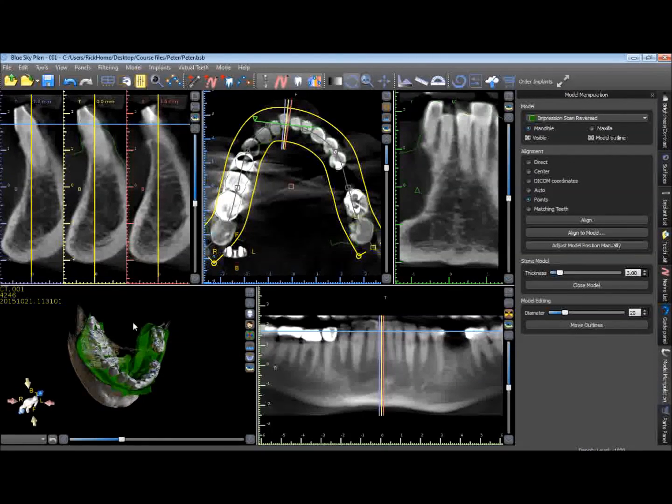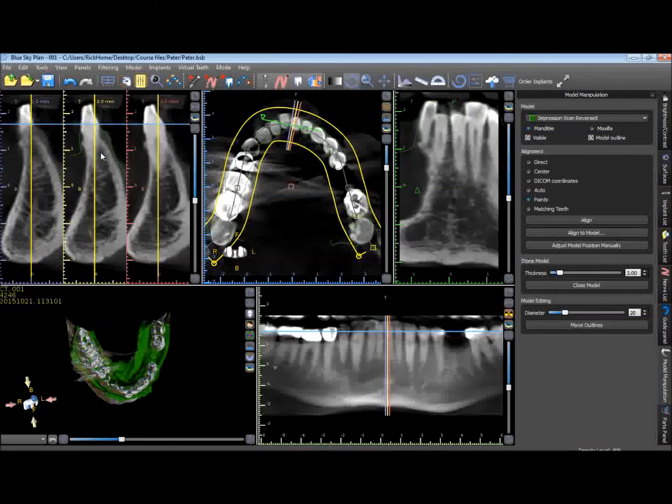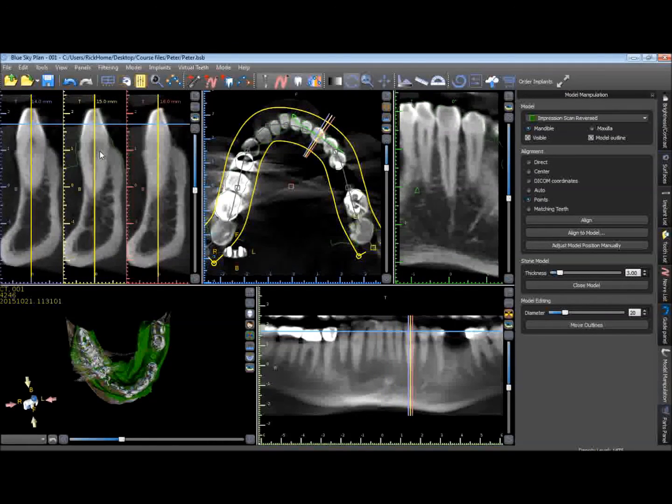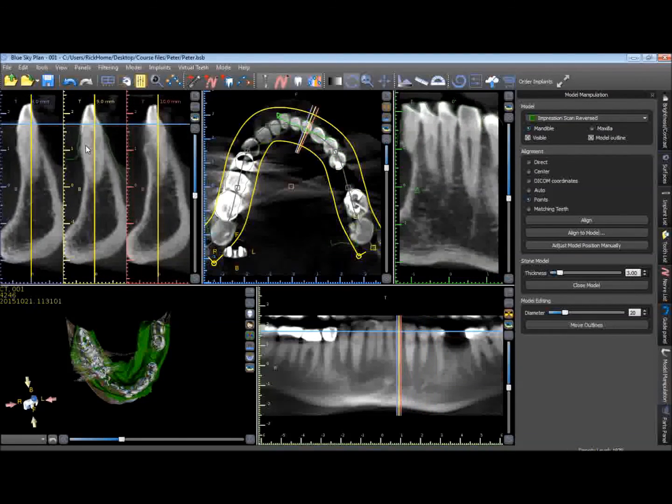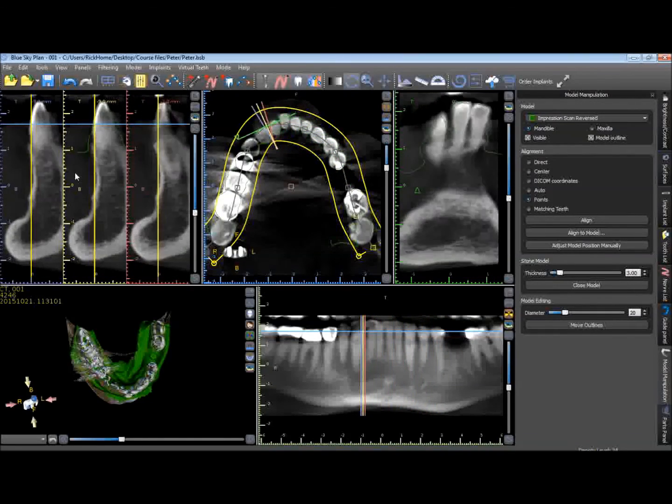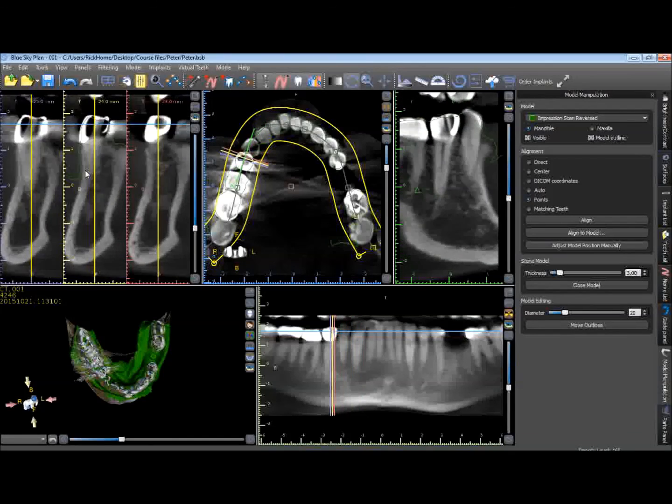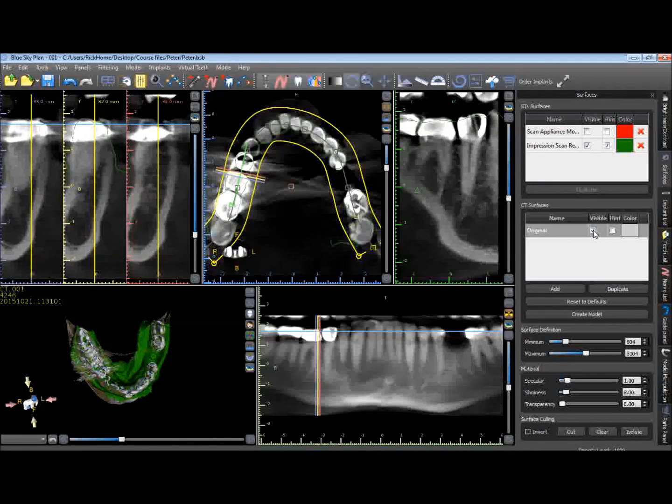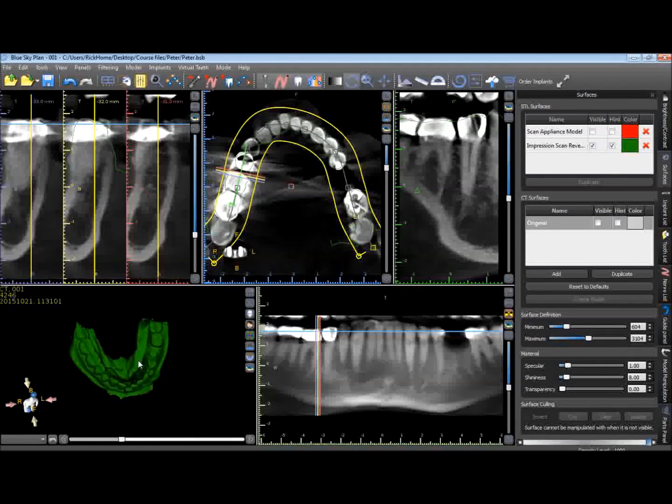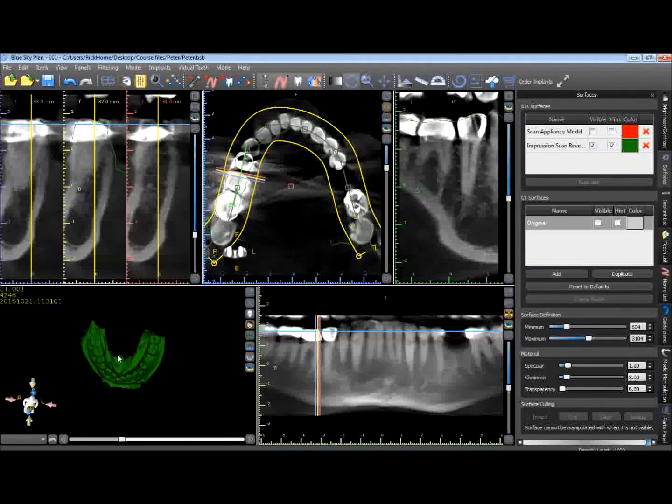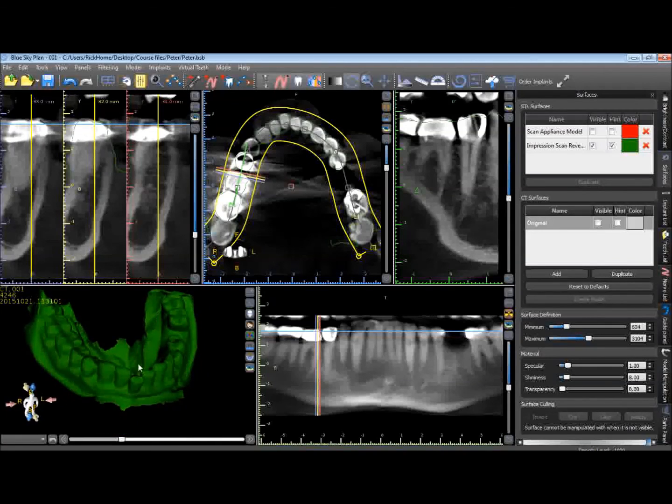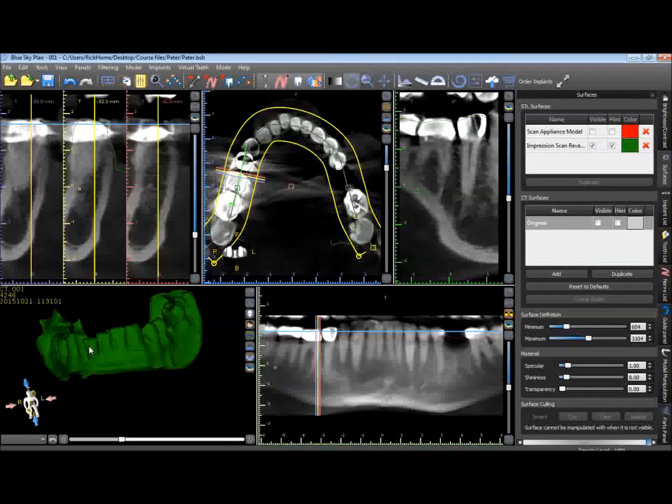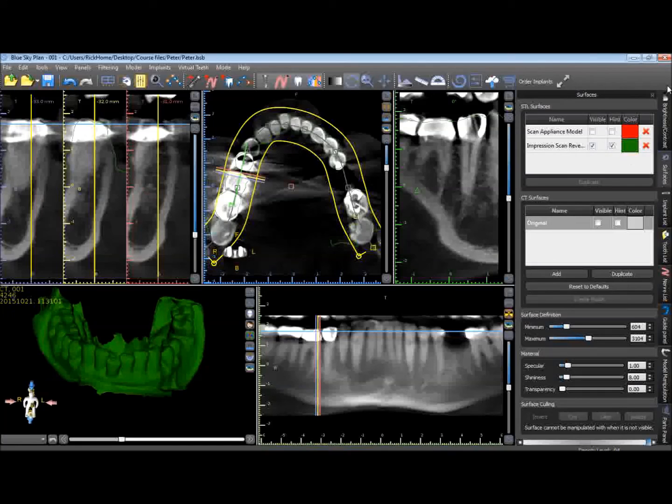And then we're going to go ahead and hit OK and see how our alignment looks. It looks like it aligned pretty well. You can see and we can check that by rotating and scrolling through the slices. That looks like an excellent alignment of these two data sets. So now we go to our surfaces, turn off our jaw scan, and plan our implant using this clean information, this clean data set that was generated from the CBCT scan of the VPS impression. Thank you.